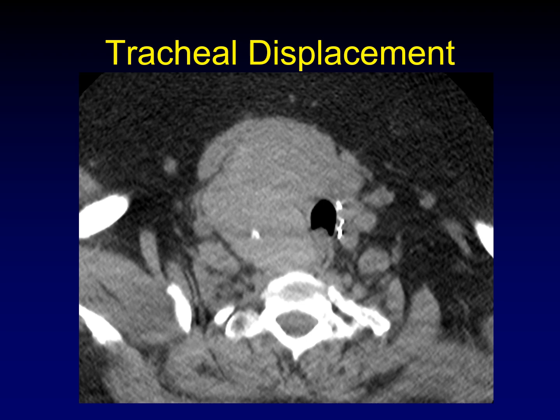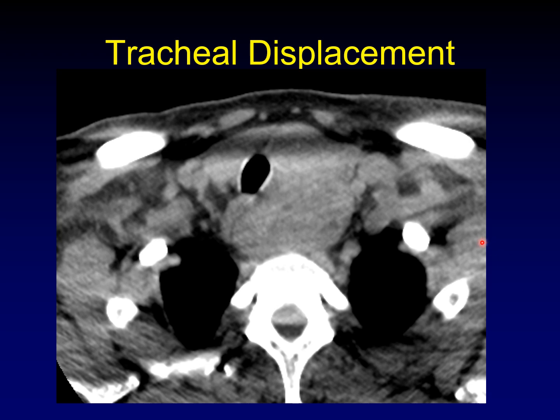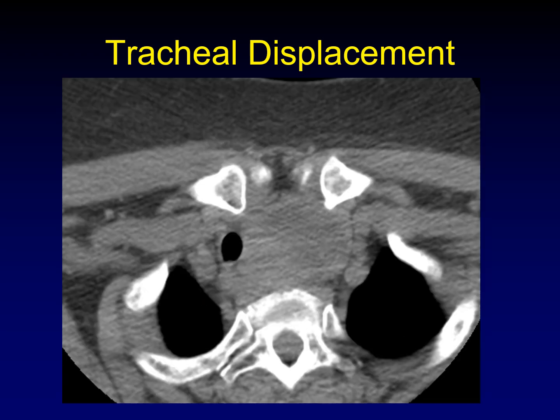We'll do the same thing for tracheal displacement, categorizing it as mild, moderate, or severe. Mild displacement is just a little bit off midline, still in front of the vertebral column. Moderate displacement is a larger mass, sort of off the edge of the vertebral column. We measure tracheal displacement right at the thoracic inlet, right where the manubrium sterni starts. Severe tracheal displacement means we're way off to the side — behind the clavicle — and you can see there's probably some stretch on the trachea at that point.